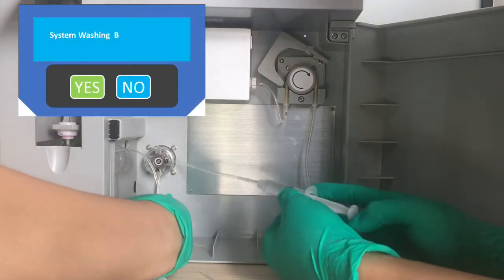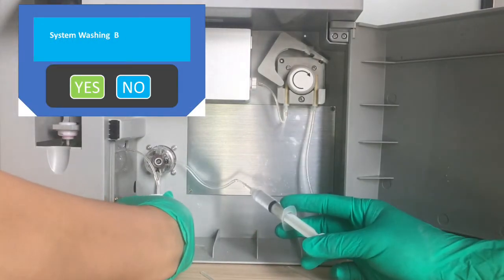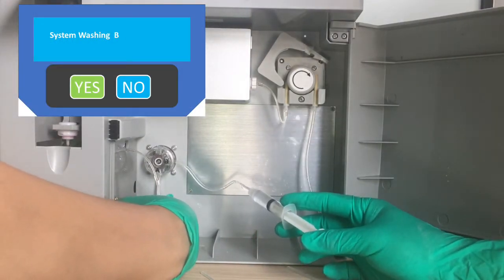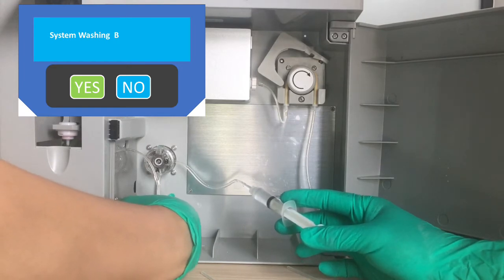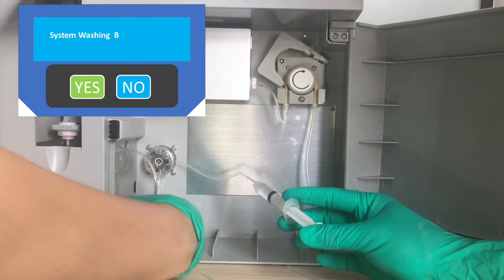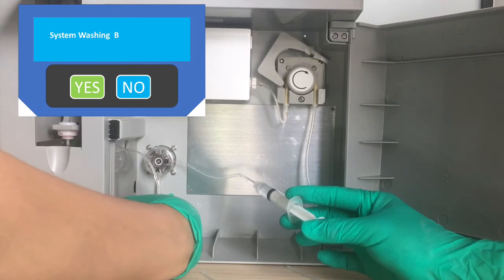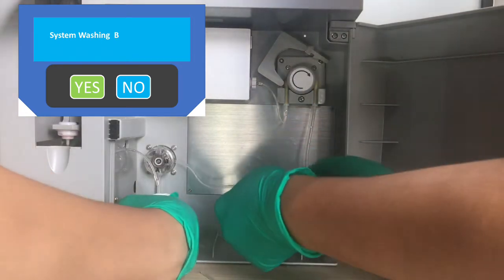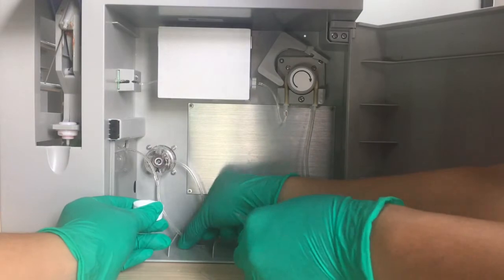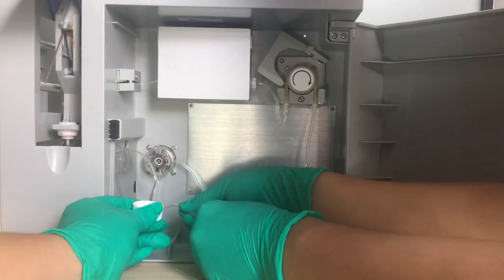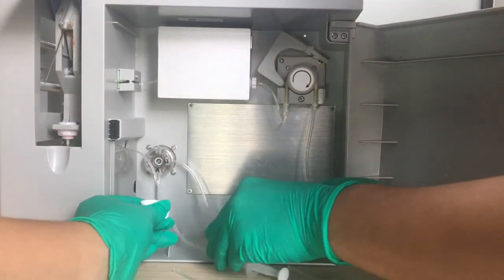Then we can switch on the machine. If there is a system washing for B channel, then we can inject water. It should come out from the center of the distribution. If there's water, this part is smooth.